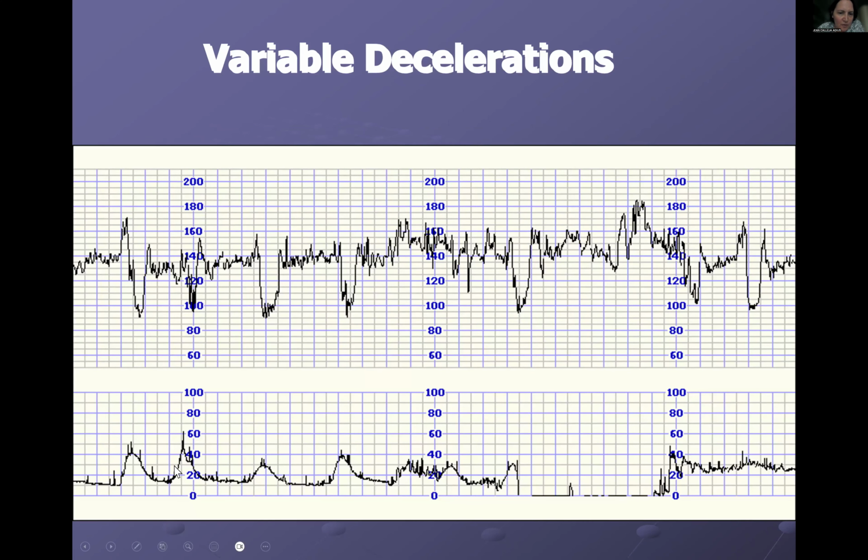So you see the contractions over here. For example, this first one, you get the M shape. So this is the baseline. There's the shouldering, what looks like acceleration, but it's not acceleration because it's followed by this dip. This dip actually is more or less over once the contraction goes, and you get then another shouldering up. So that is a typical variable.